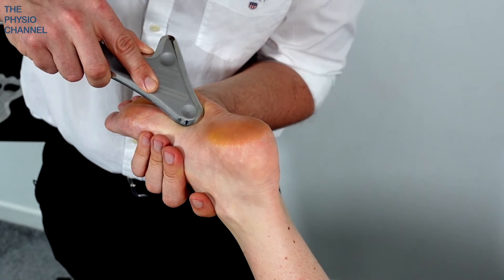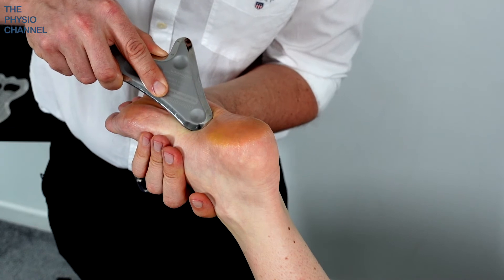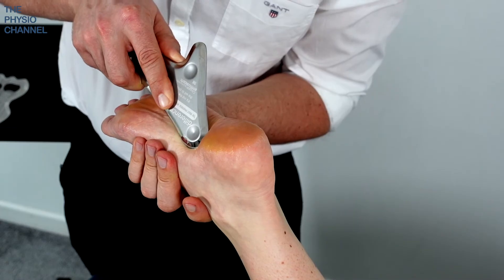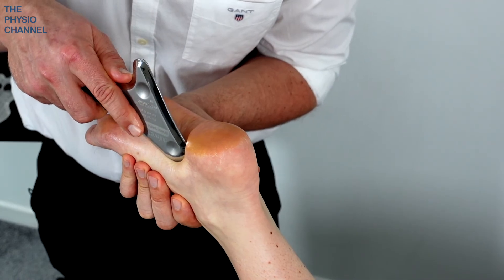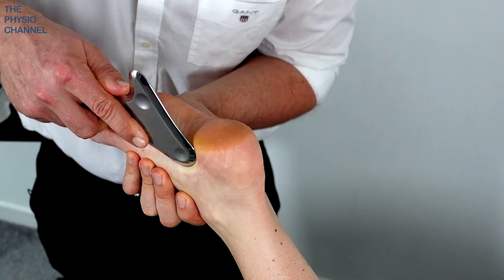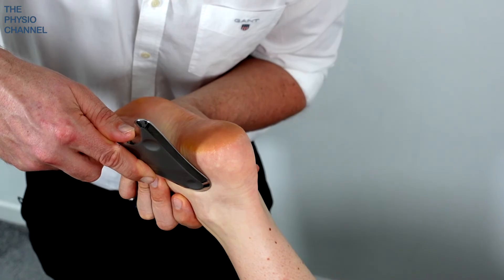All the way down — as you approach the calcaneus, rather than riding straight into it, change the angle of the tool and sweep down into the medial side of the calcaneus. You're then starting to track the root of the tibialis posterior, so you can finish your treatment around the back of that medial malleolus.